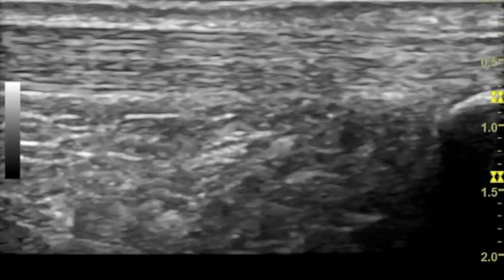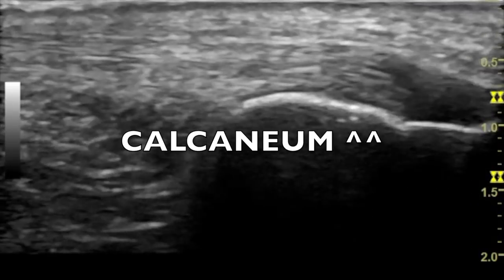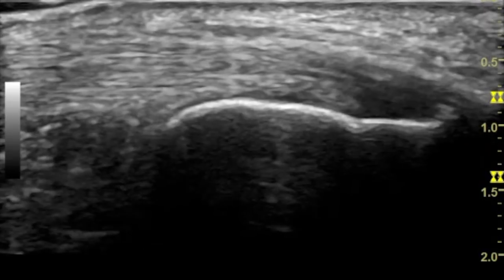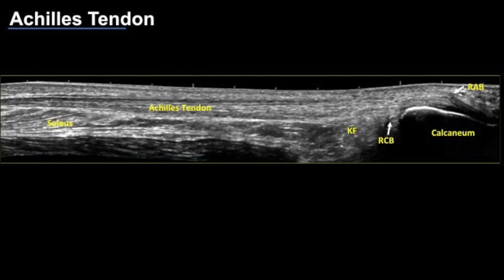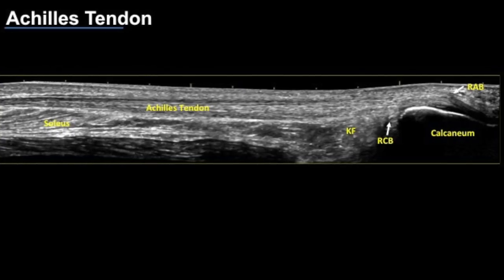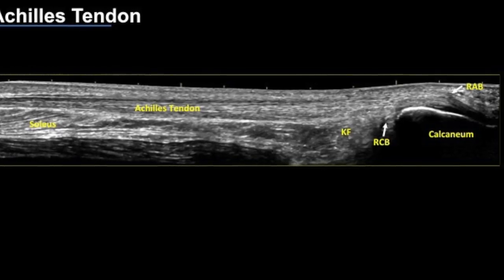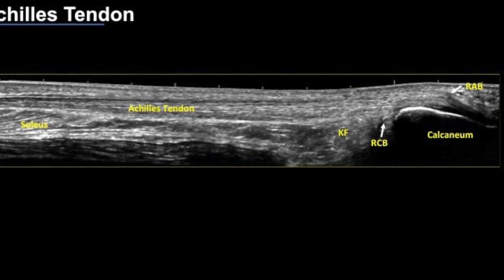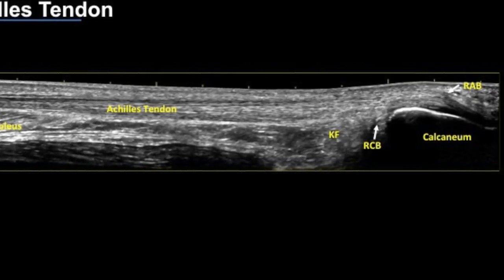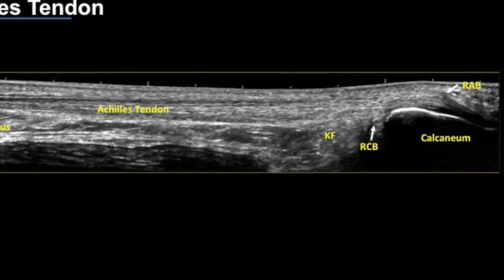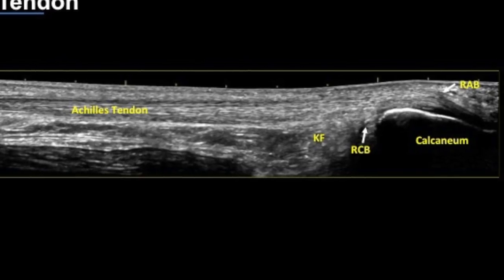On the long axis we see the Achilles tendon as a fibrillary structure as it attaches over the calcaneum. There is a hypoechoic area in a segment of the tendon caused by anisotropy — as the collagen fibers curve anteriorly to attach over the calcaneum, this anterior turn creates an artifact known as anisotropy. You should be aware of this before labeling the tendon as insertional tendinosis.